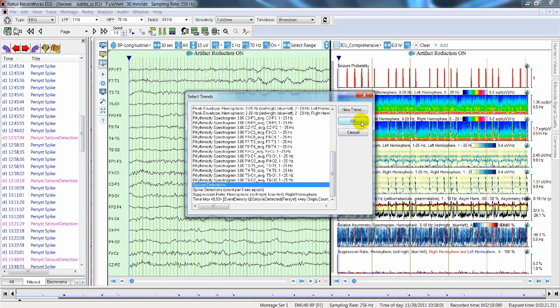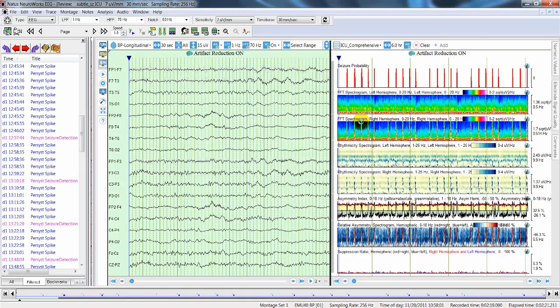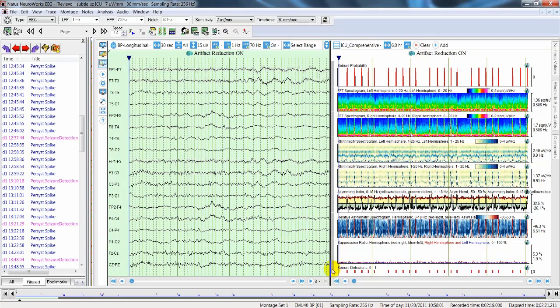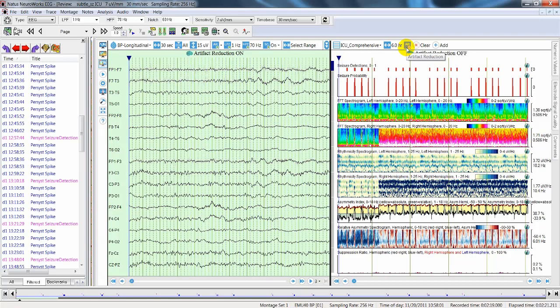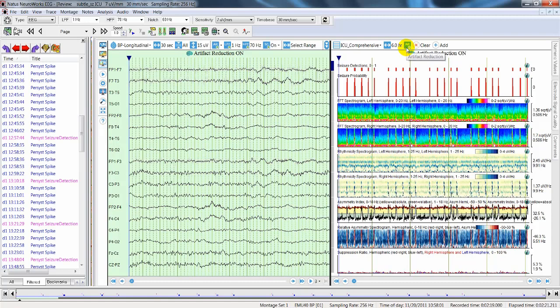The system immediately adds the trend at the bottom of the panel, and you can move it to the top. Even in the trends view, artifact reduction can be enabled, so if EEG waveforms are noisy, trend calculations will not be affected by the artifacts. Clicking the AR button you can see the effect — now the artifact reduction is off, and now it is on again.